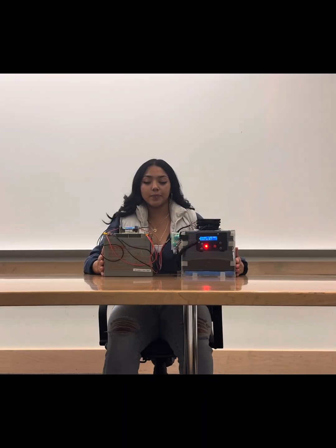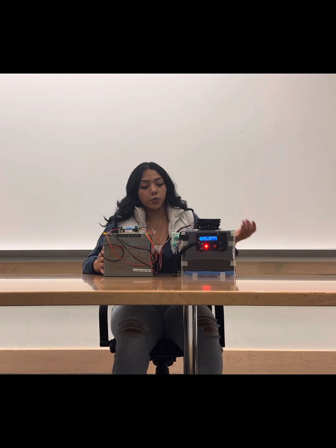Okay, I'm going to talk about some improvements that we can put in our design. So as Nate previously mentioned, our transformer isn't the best. It's not able to maintain and reach the ideal voltage and amperage that is needed. And our battery can also be better. So it is able to reach 32 degrees Fahrenheit, which is our freezing temperature, but it isn't able to maintain it for 24 hours. A bigger battery would be needed to do that. And we can also get better Peltier devices. These are a little bit cheaper, so they're not as efficient as more expensive ones would be.